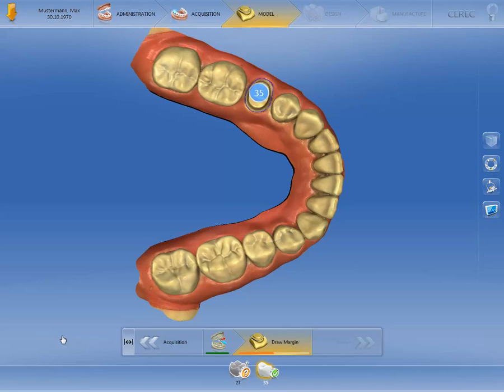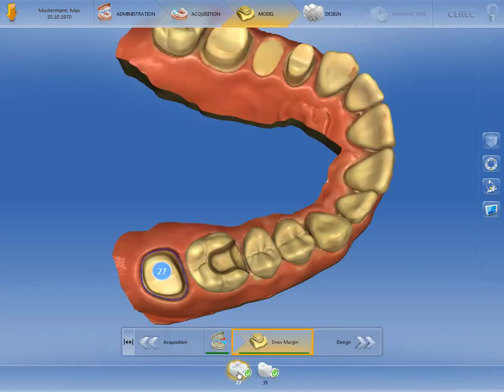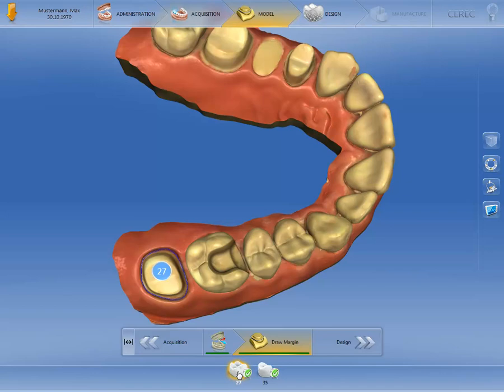With multiple restorations, you can move back and forth between the restorations by clicking on the symbol. The step is highlighted in green and all restorations have a green check mark once the second Preparation Margin has also been determined. In particular with single tooth restoration indications such as inlays, onlays, crowns, and veneers, the restoration type is detected automatically by the software once the Preparation Margin has been determined. Our case involves two crowns.